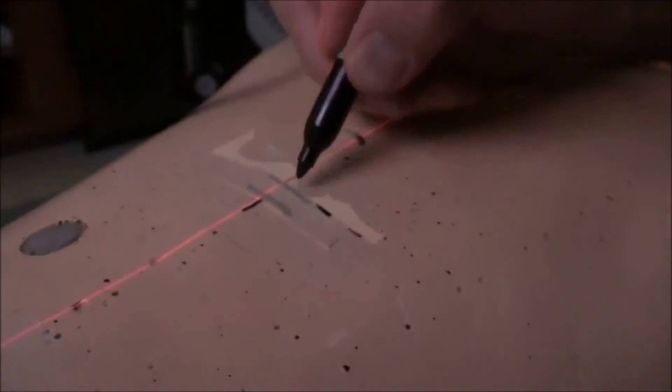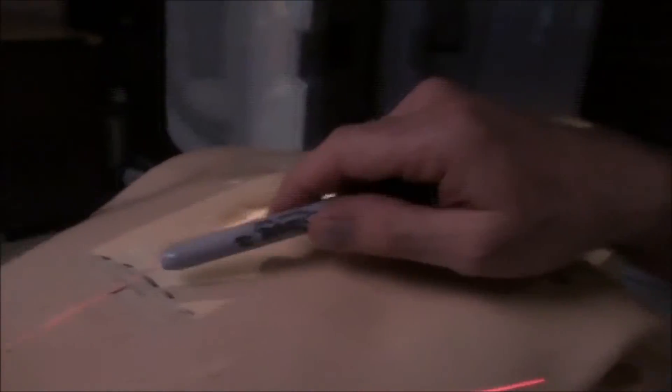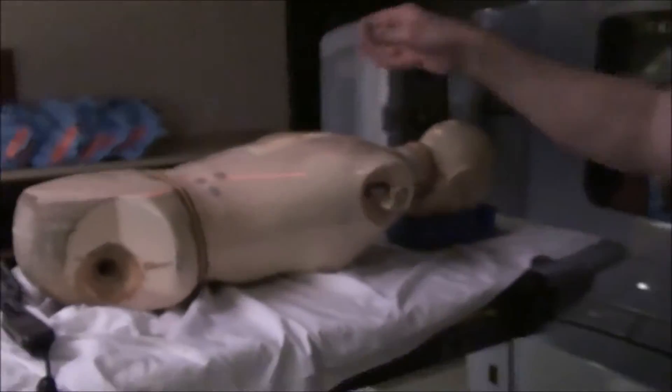Mark your match line at the inferior border. So now we've got our match line at the top, our next match line at the inferior border, and our depth set. Treat this field.